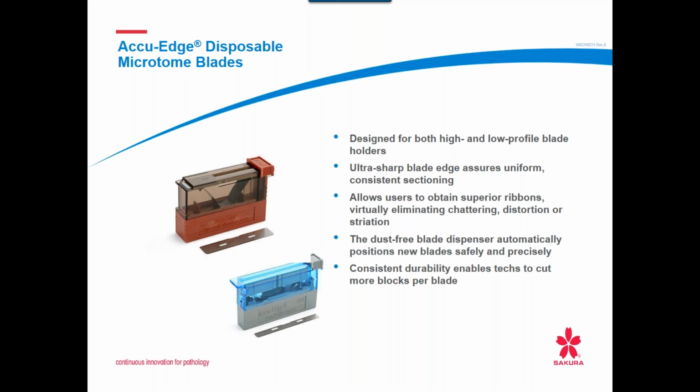All right. We have another question. Can you give an example of what you do or use for blind samples for IHC competency? Usually we will use the proficiency testing. Depending on what vendor you use for proficiency testing, we use CAP, and we have our MKs that we get from CAP.